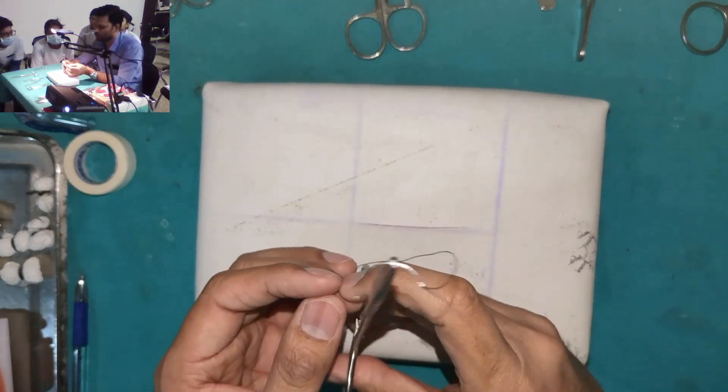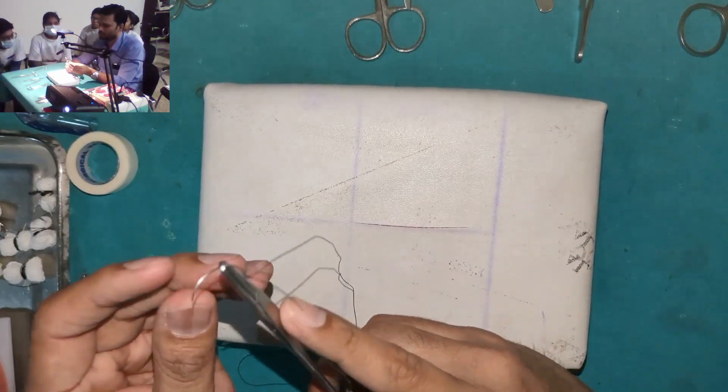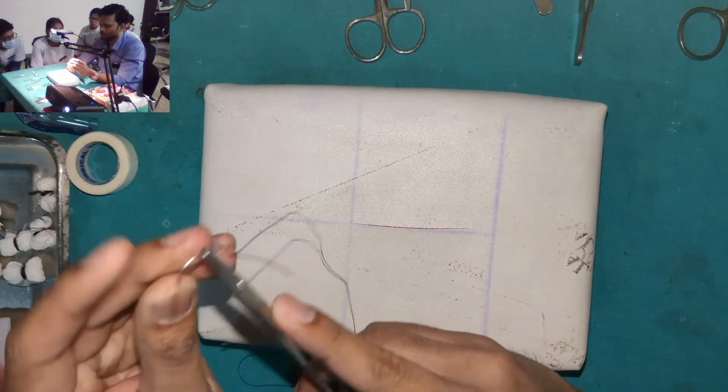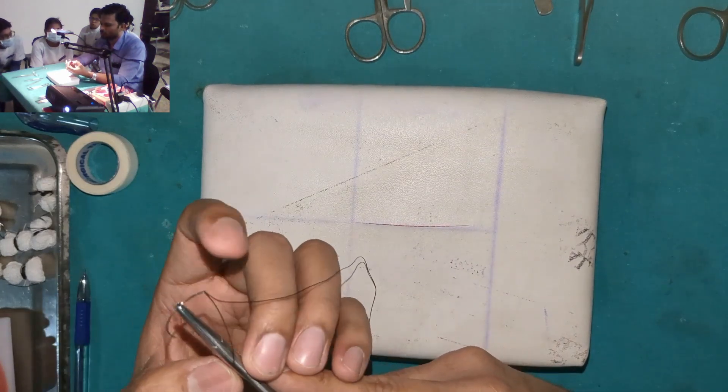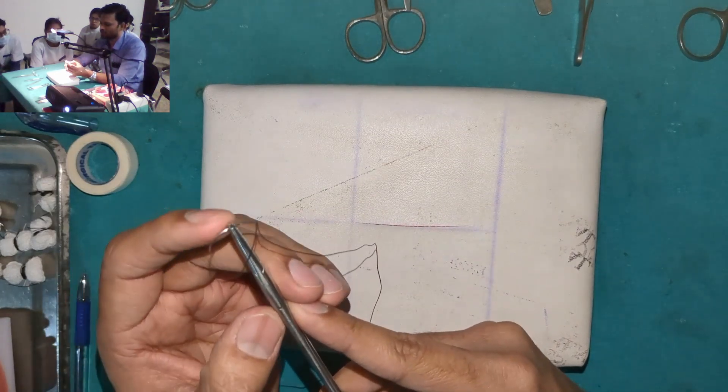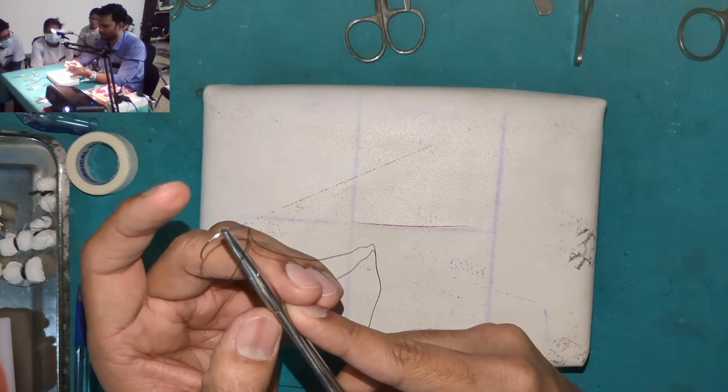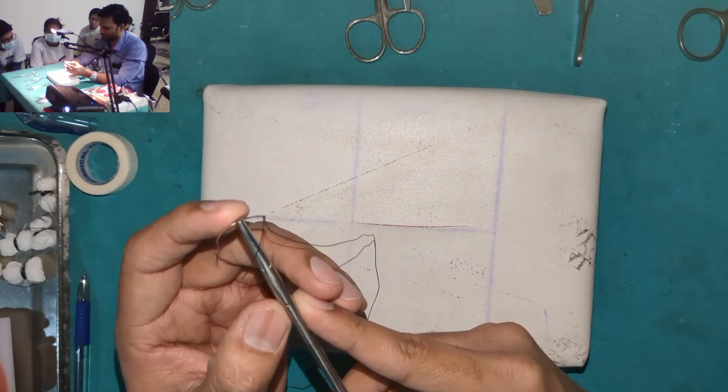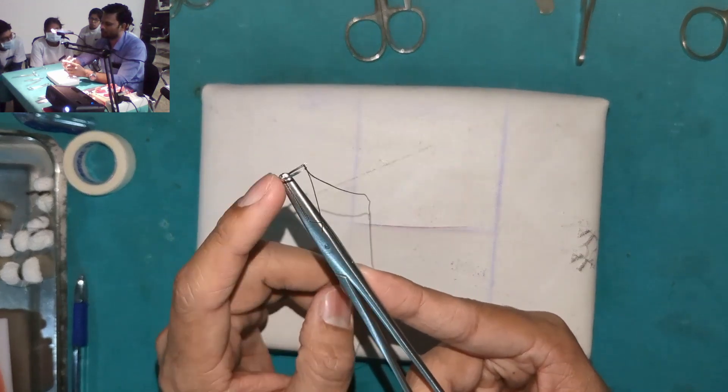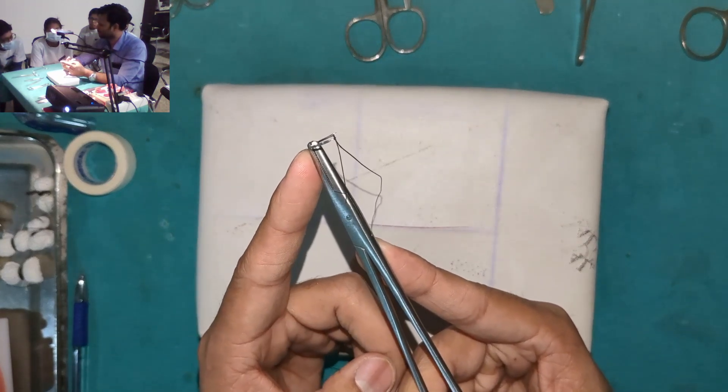If you remember your principles of suturing, one third distance from the eye or two third distance from the tip of the needle. That is one principle. Second principle is the needle should be held at the tip of the beak or the jaw, needle holder.